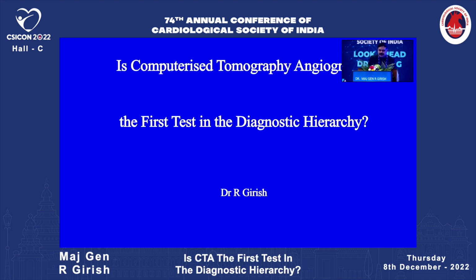As you're all aware, cardiac imaging is absolutely essential for diagnosis and management of coronary artery disease. In this regard, cardiac CT, the multiparametric cardiac CT, has of late proved to be a very superior tool. So much so that several guidelines, including NICE, European Society of Cardiology, AHA-ACC, and SCCT, the Society for Cardiac CT, have all recommended this and given a class 1 recommendation for certain situations.